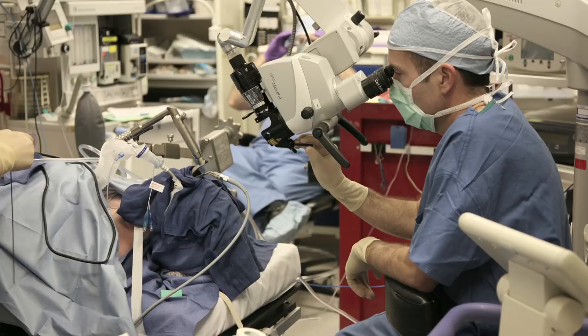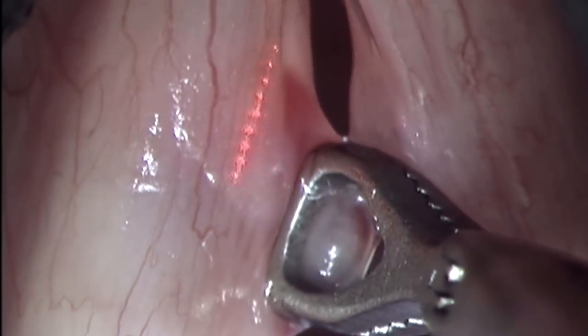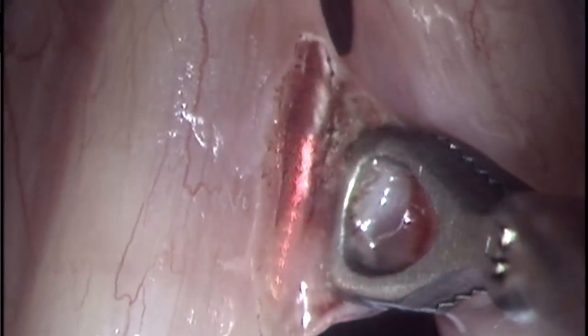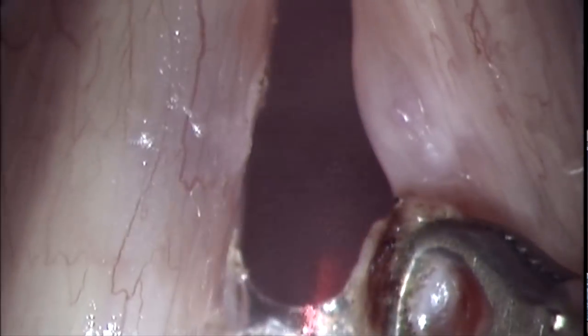We did a surgery where we grasped her polyp, pulled it away, and used a programmable laser to cut off the edge of the polyp. We let it heal, and now let's look at her outcome.